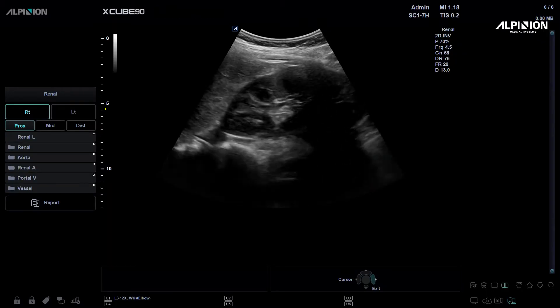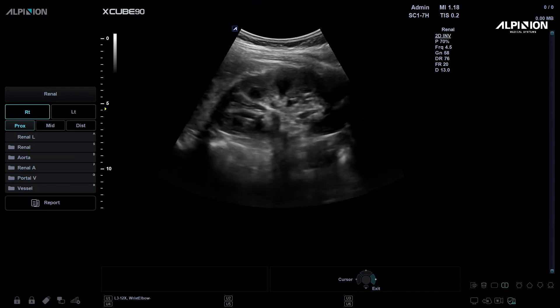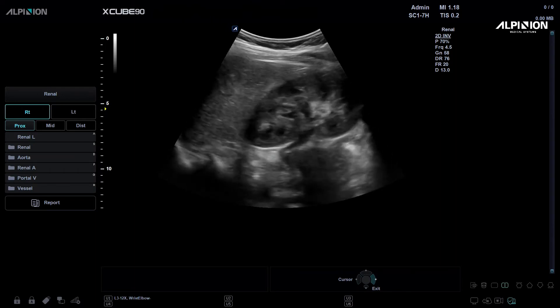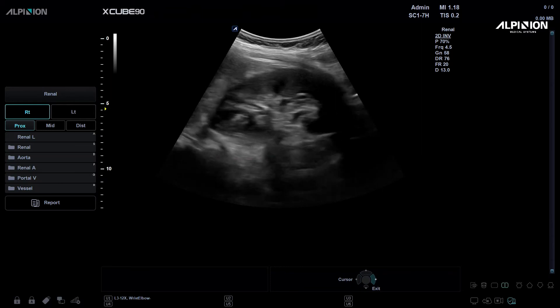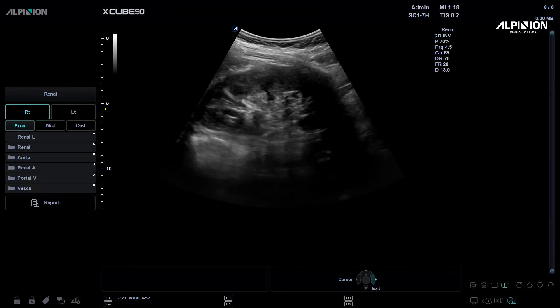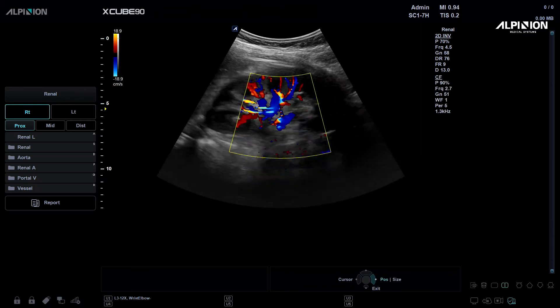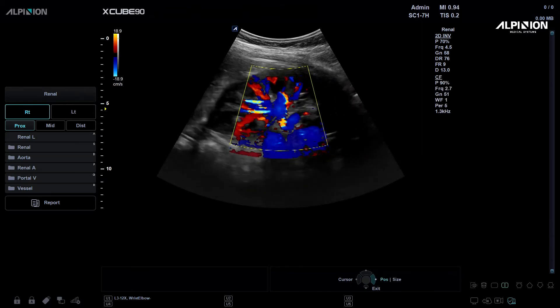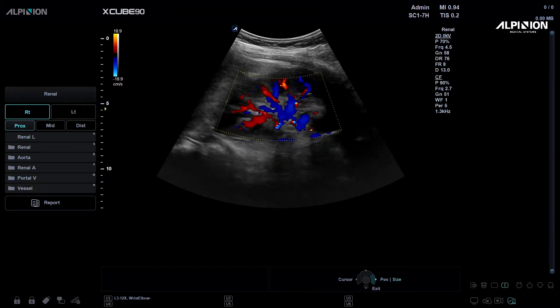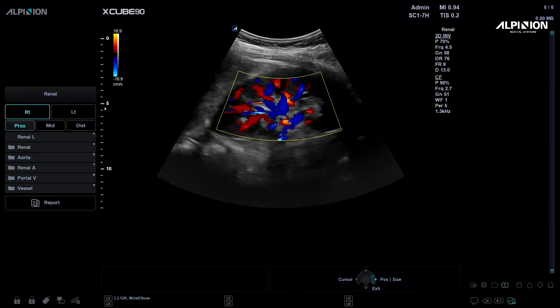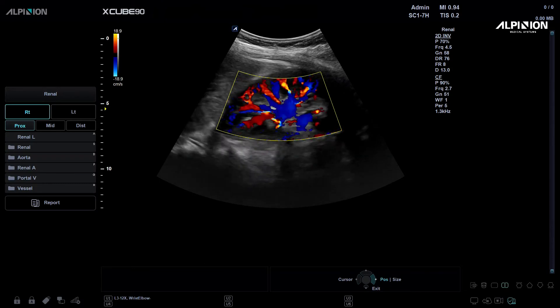Now we'll show you the difference. This is the B-mode image of the kidney. This is the Color Doppler image, and in this mode, you can choose between Power Doppler and Expo's micro-view by simply pressing a button on the touch panel.